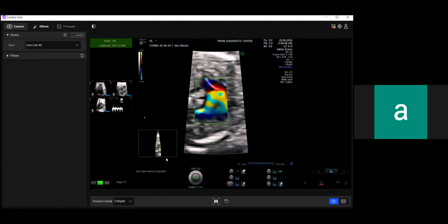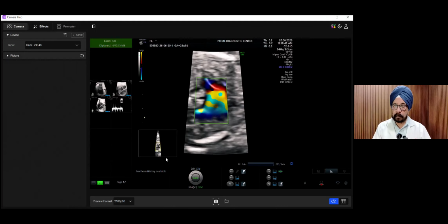And one more question. When you do screening, how do you check for the pulmonary veins, and in fetal echo do you see all four pulmonary veins or are two enough? We try to attempt all pulmonary veins, but many a times it's challenging.